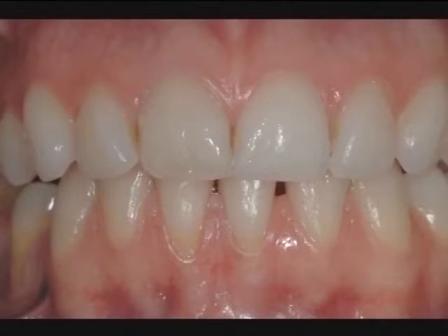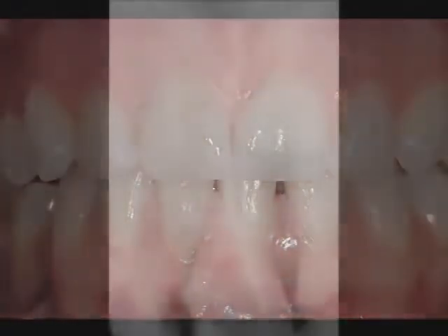Additionally, we are going to try to preserve the buccal plate from our extraction and place the implant atraumatically, and then reconstruct the tissue and bone at the same time, using our temp stent provisional to sculpt and mold tissue contours throughout the healing phase.